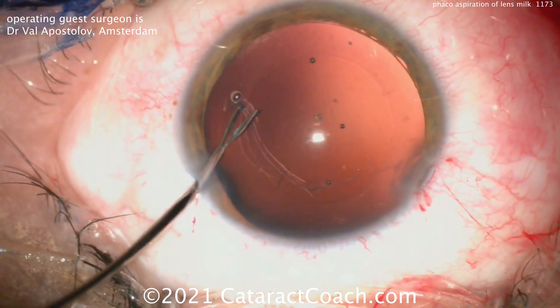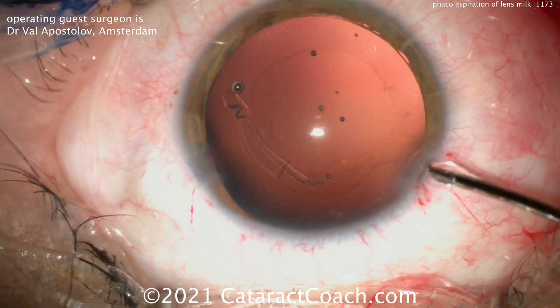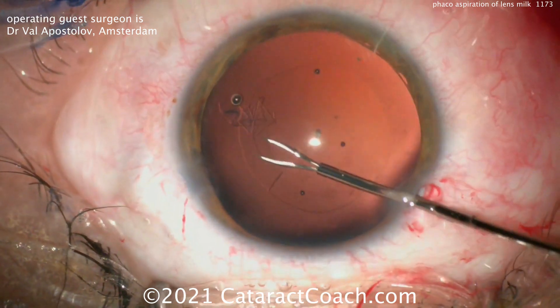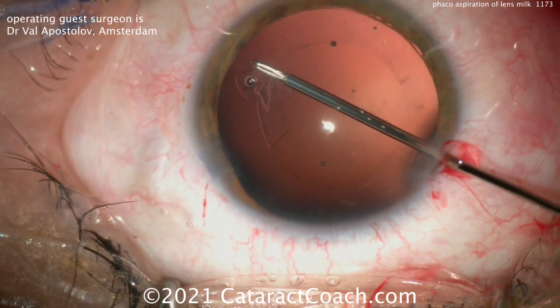What's interesting is there's still no main incision yet — just two paracentesis incisions and no main phaco incision — because the lens material was so soft it was removed very easily with bimanual irrigation-aspiration through those two side ports. Now finishing up the rexis.